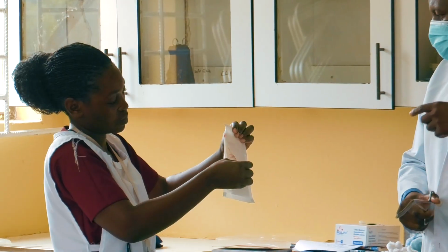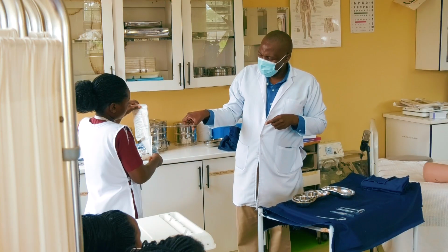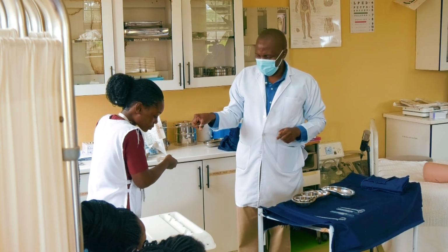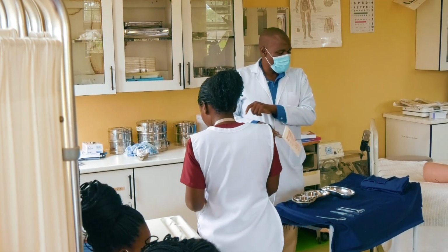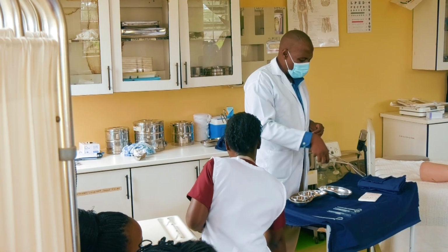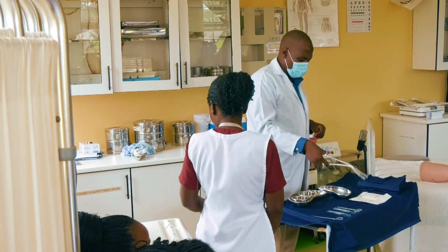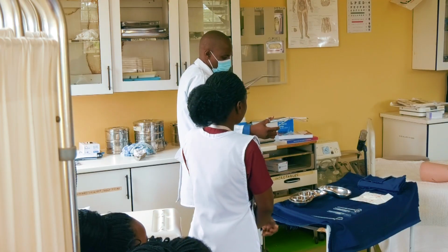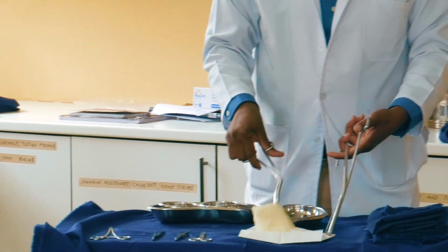Now again, the way she's doing things, it's like she's even touching this. She has to come somewhere here, stand on the side of the trolley, then get this, because as I move this, I may risk dropping it. Whatever you are receiving, receive from the side. So even these gloves, I need to put them in readiness for use. Just open this one, then I think I need the other sheet of forceps. Put them like that, remove them from here so that you don't go and suffer.